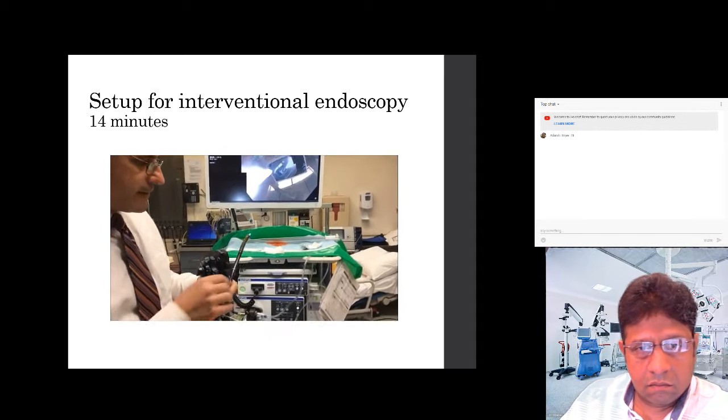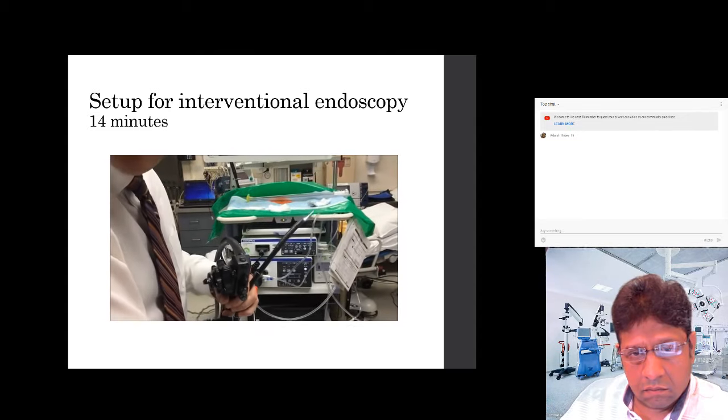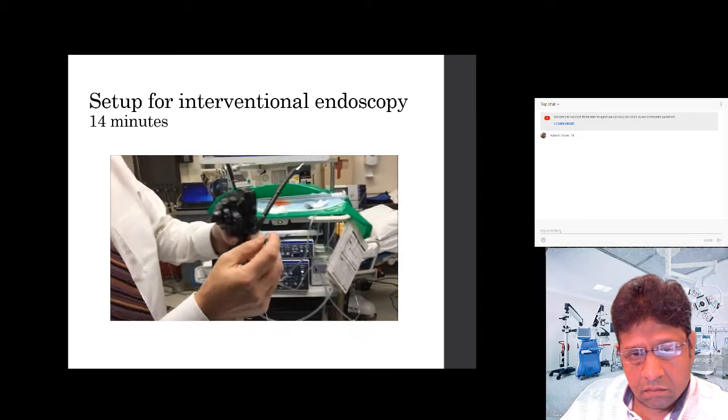Sometime. Okay, there it is. Now, pass it a little bit more. So now you have this end here, okay? Now we take the actual bander. This is what it looks like.